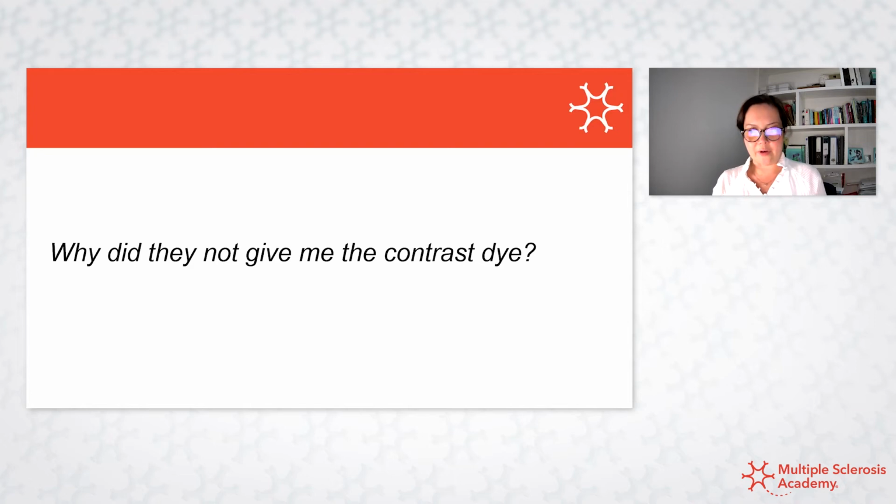There is no evidence of harm, but it's instinctive that we don't want to wait till we get evidence of harm if it does indeed come. So we use gadolinium when we need to use gadolinium for a diagnosis or to show something. But in monitoring of MS, by and large, we don't need it.